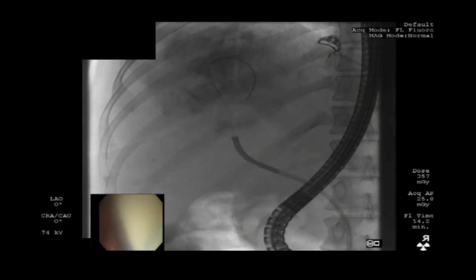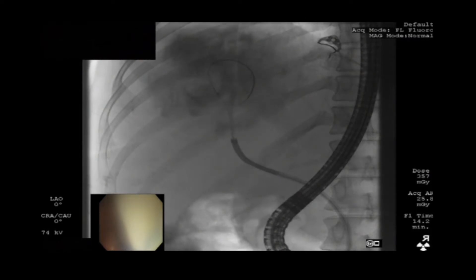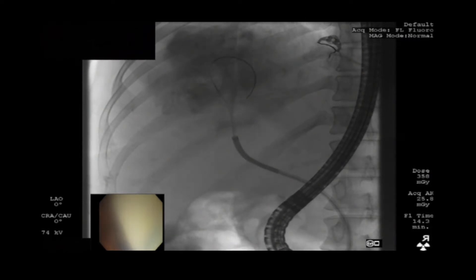400 milliliters of hypertonic saline was injected through the cystobiliary fistula to inactivate the germinal layer and to kill protoscolices remaining in the cyst cavity.